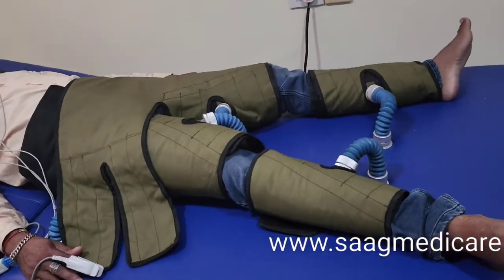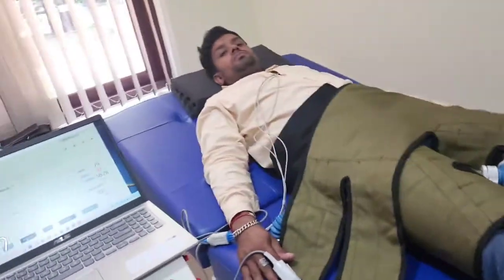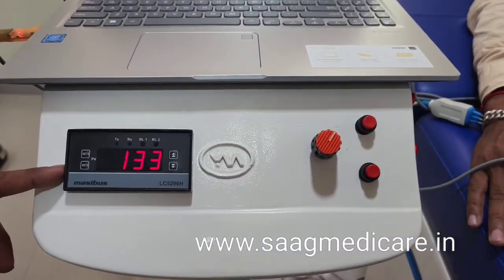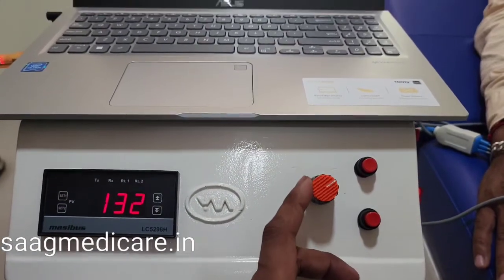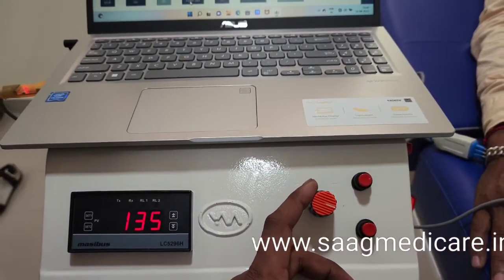We can see the counter pulsation starting. The cuff is inflating and deflating, and here we can see the set pressure. We can adjust the pressure by rotating this knob — it can be varied from 0 to 400.